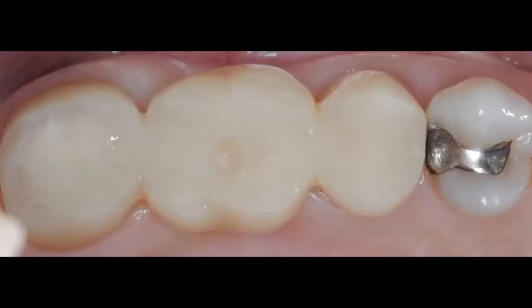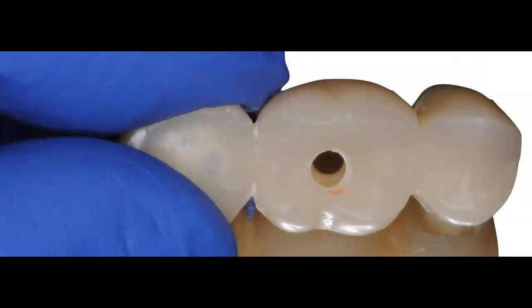So there you are. You can see that directly in the patient's mouth, I'm going to use a number 4 high-speed round burr, and I'm going to go right in the center and make this little notch right in the center of that implant site, slightly towards the lingual, just like you're seeing it, of the temporary, of that pontic of that first molar. So my idea is I'm going to then retrieve this from the patient's mouth and use a lab burr to create a hole a little bit wider than 2 millimeters right in the center of this fixed dental prosthesis. And what is my goal now?